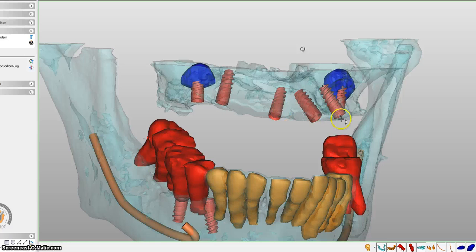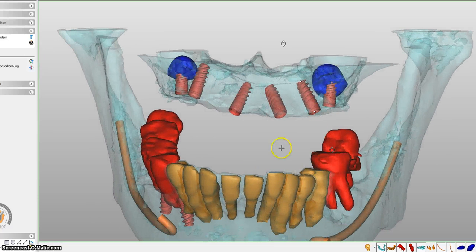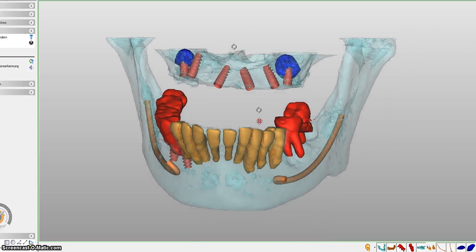Those little pins are placed on 2 implants in the upper jaw, and you could place the denture inside your mouth, and it doesn't only hold with suction like the first option, but it also holds by 2 implants.